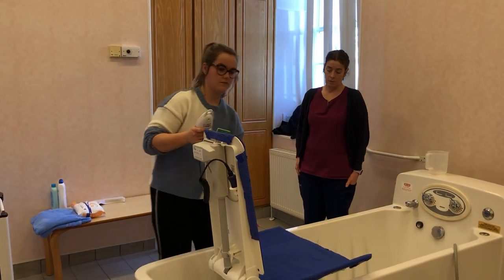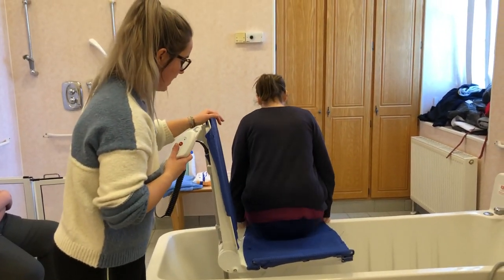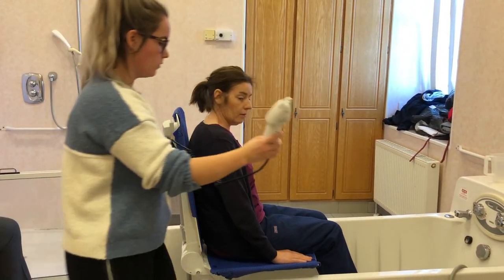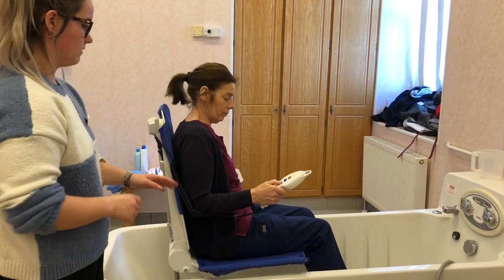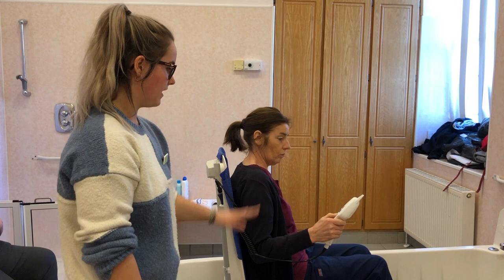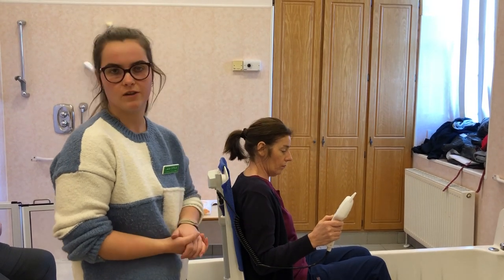When it's right up level, get your client to sit onto it and move back in the seat as far as they can, then swing one leg over at a time. You can give them the remote and get them to push the down arrow to lower themselves. Recommend that they fill the bath halfway with water, then lower themselves down, and fill it up a bit more if needed.